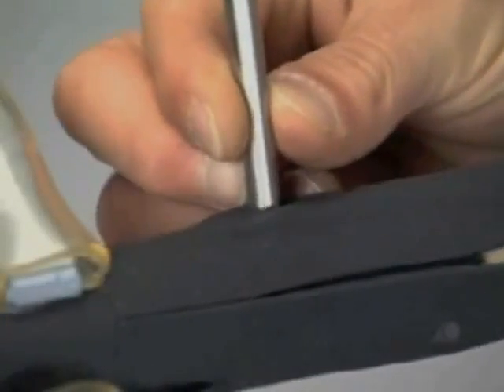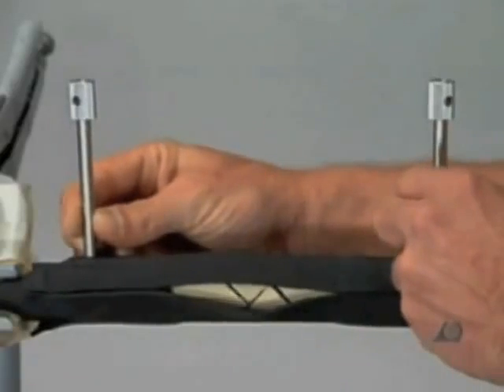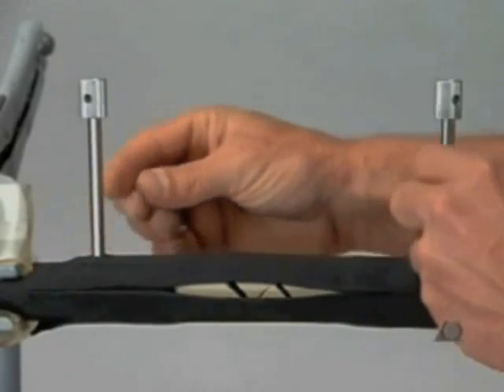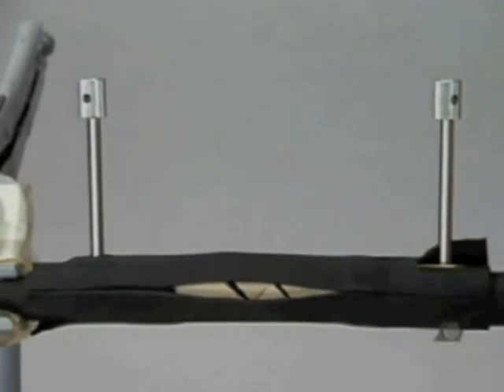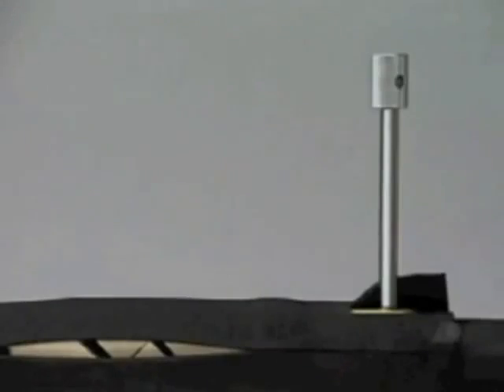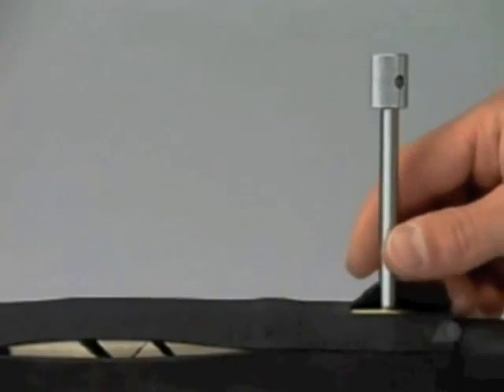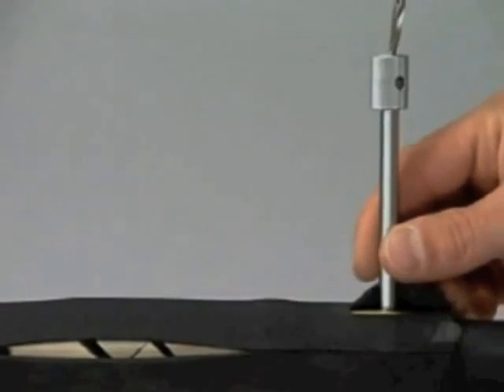The reduction of the fracture, as well as the position of the plate, should be checked once more. The plate is now fixed to the bone at one end by a locking head screw inserted bicortically.